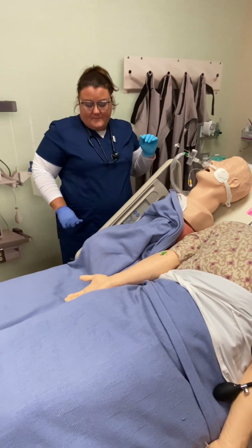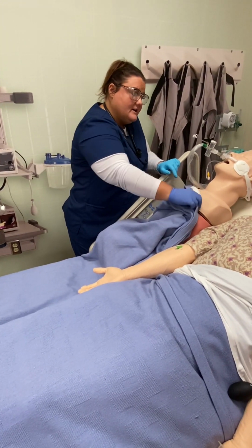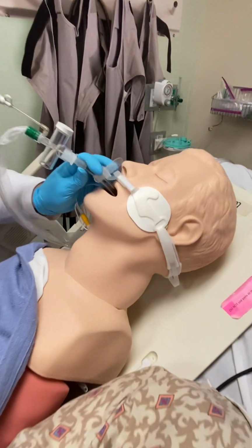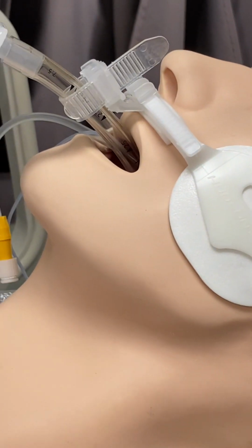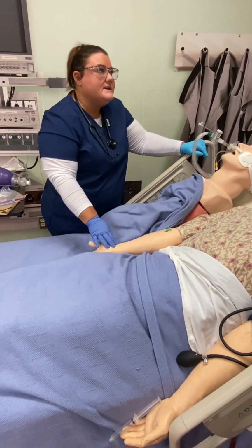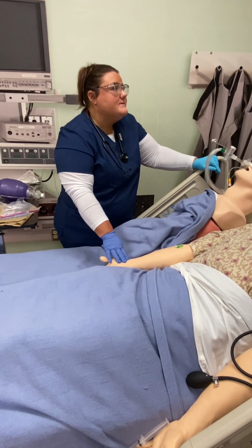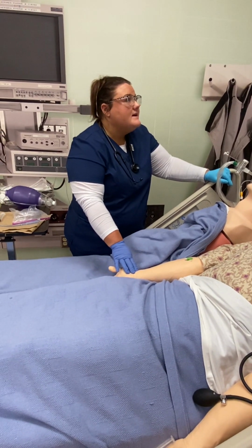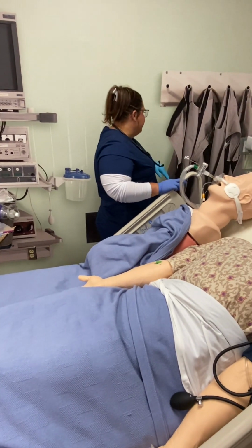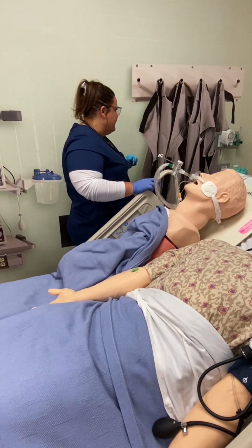Great. So now that I've assessed that, I'm looking at his work of breathing, his overall color. I'm gonna check his tube depth to make sure that it matches what I have in the chart. And it's saying 25 at the lip. Okay. So now I'm just gonna check his pulse, and I am checking his heart rate, his respiration rate, his SpO2, his blood pressure, and his EKG. Okay, everything looks good there. So I'm gonna check his vent and make sure that his graphics look good, and make sure that he doesn't have any leaks going on.